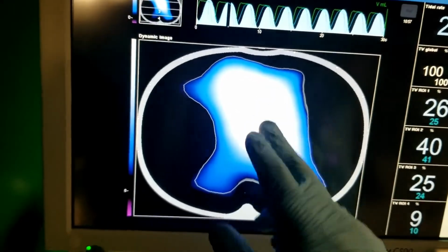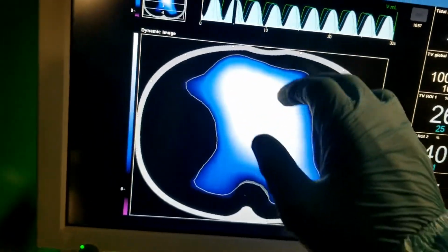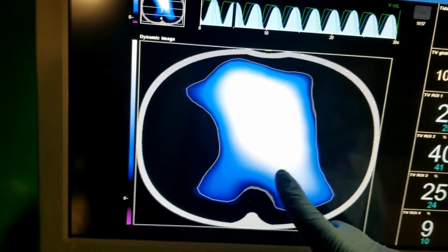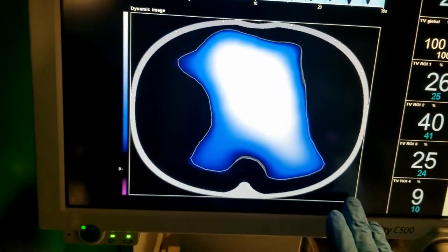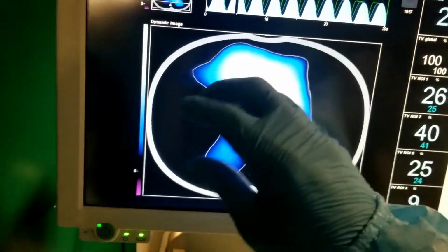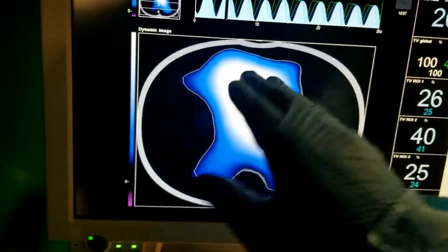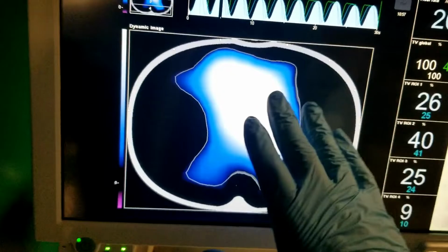And what you want to do is, it's okay if I reduce the power of the vent and I'm losing the intensity here, because it might be indicative that there's a little bit of over distension. You want this white distribution that's considered the maximum amount of ventilation to be as evenly distributed as possible. So, I mean, you do have some white saturation. I'm not saying it's all blipped over here and that's where all the tidal volume's going, but it's also a quick, immediate way to say, oh, a lot of the tidal volume is going to the ventral and mid-ventral regions.